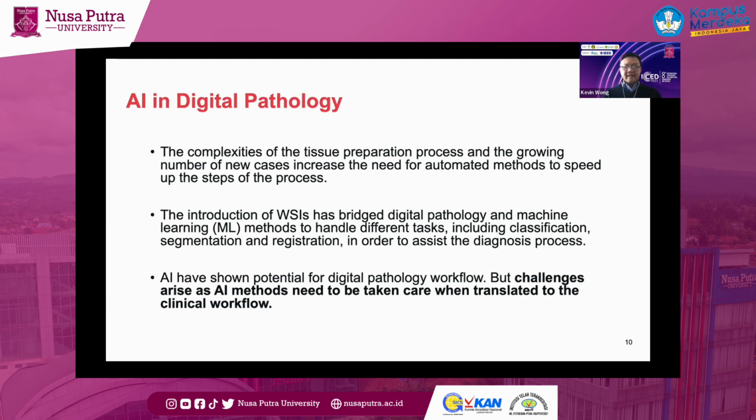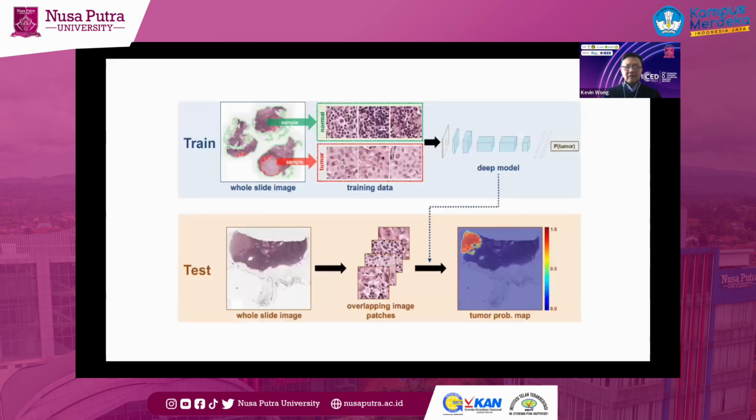And the next thing you need to do is to actually translate it into the actual workflow so that you can actually use it. So this is what we are looking at today. Before we look at that, I'll just give you an overview. The most commonly used machine learning for digital pathology is deep learning, and quite many papers have been published. This slide more or less generalizes some of the work that has been done.